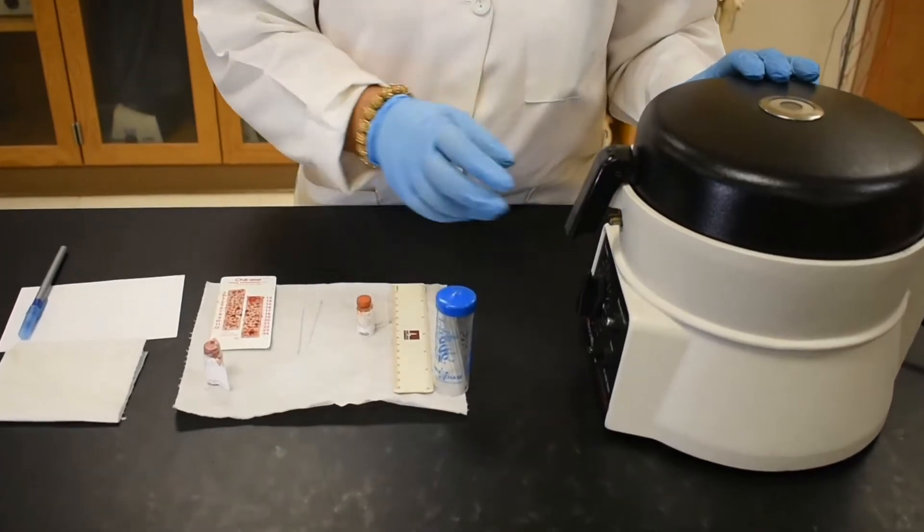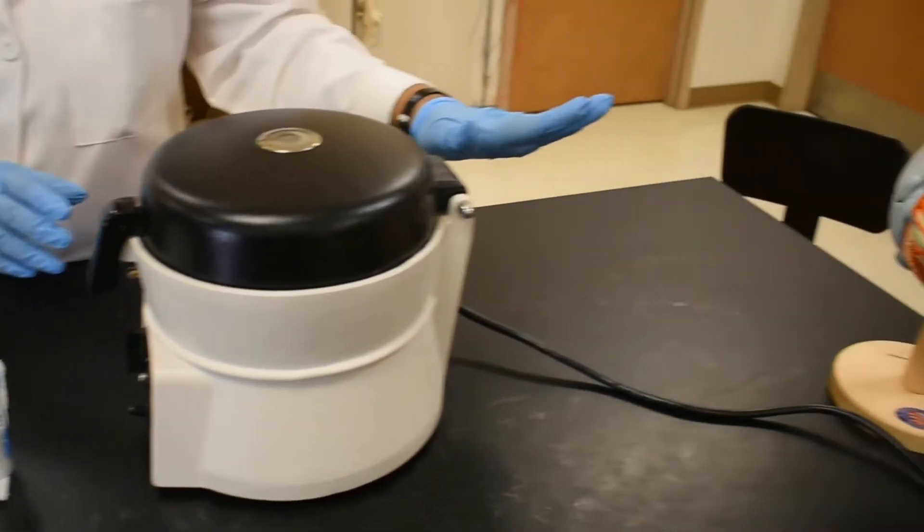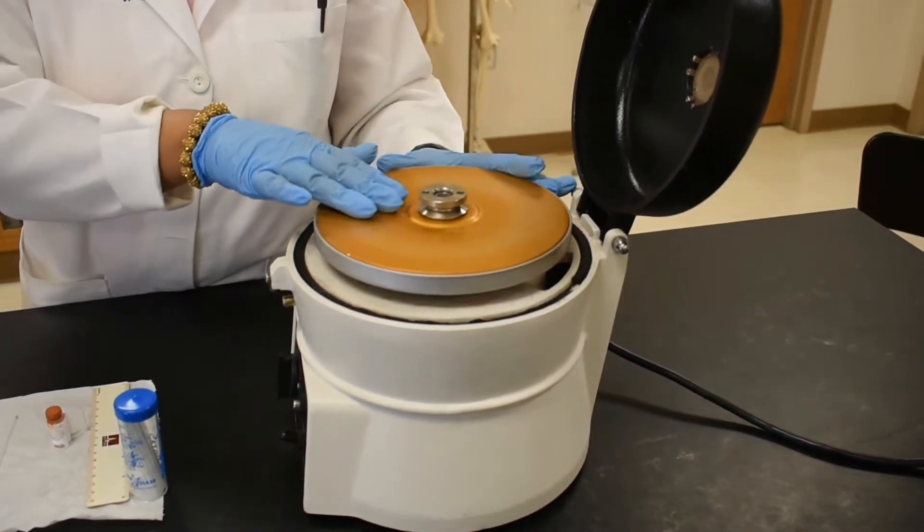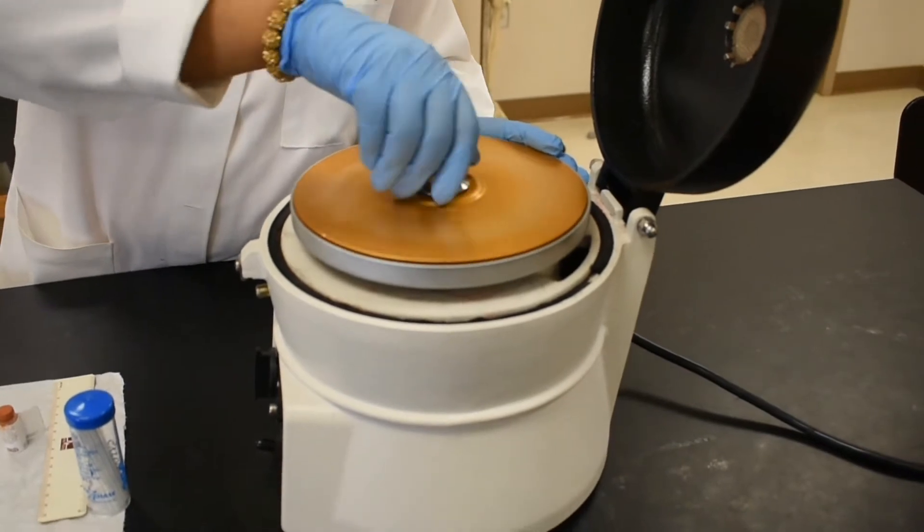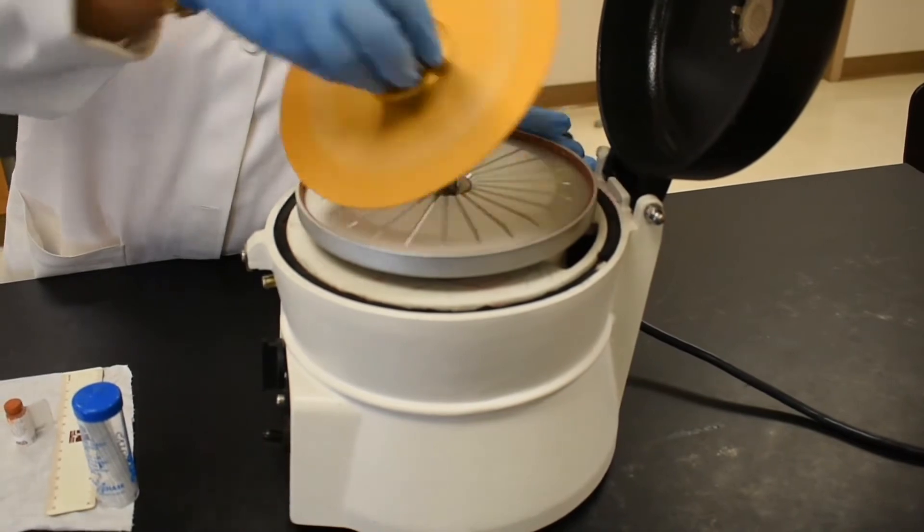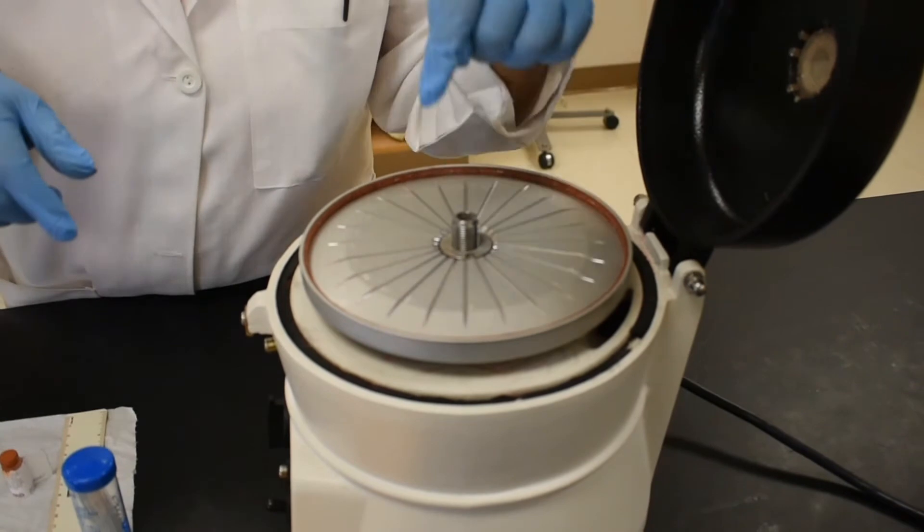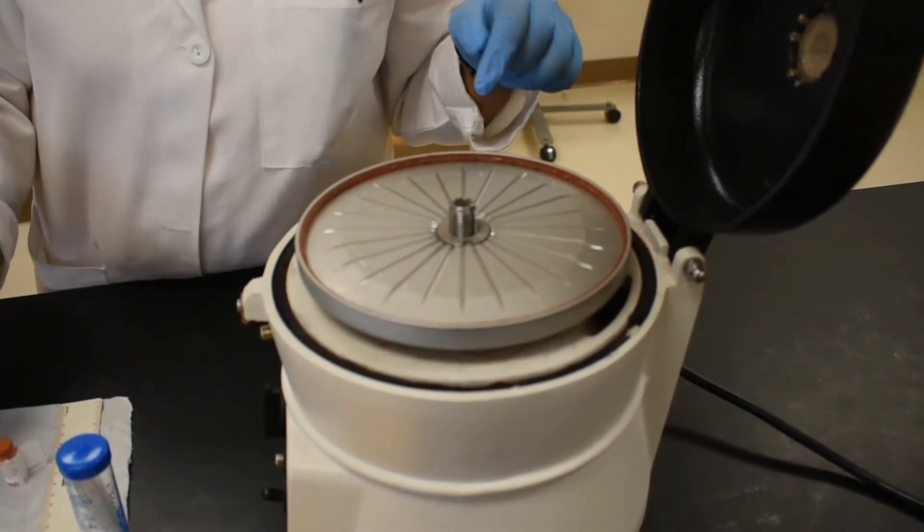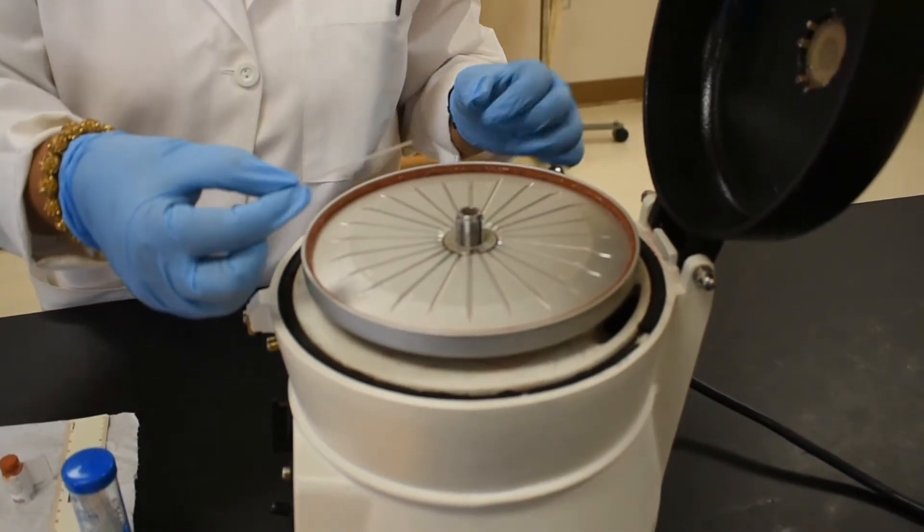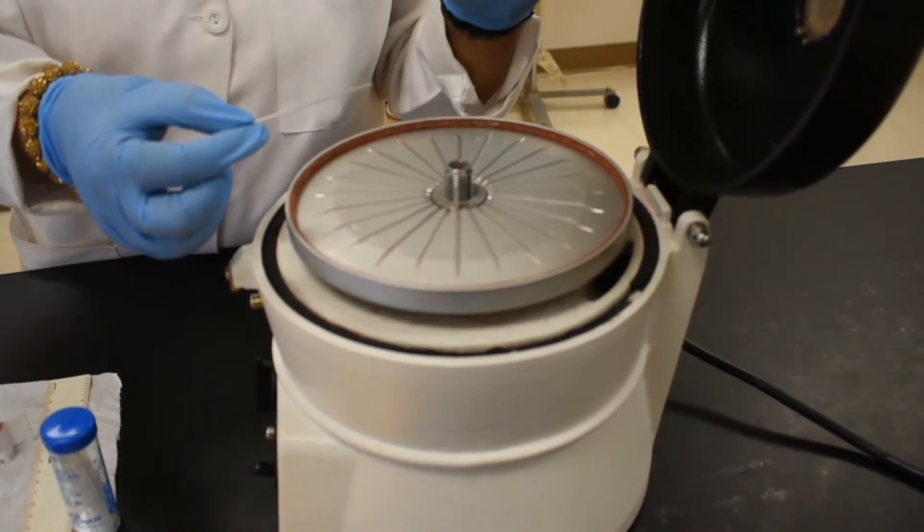Before we draw the blood, make sure everything is ready with the micro centrifuge. Plug it in. Then when you open the lid, there is another screw cap. Unscrew it. And now you can see the slots inside the machine. Within these slots we put the capillary tubes. That's why this instrument is called a micro centrifuge machine.